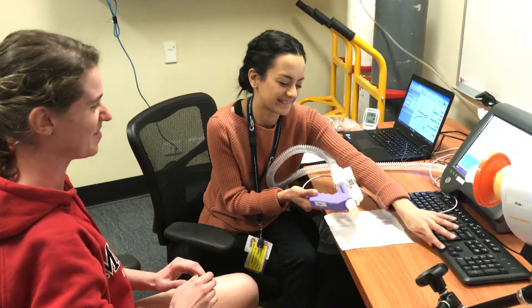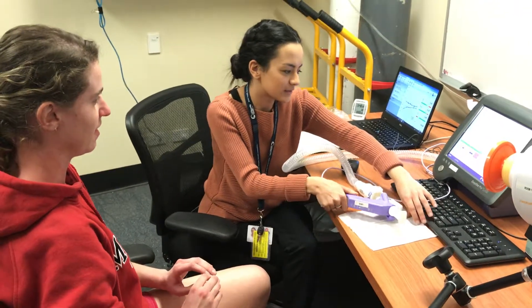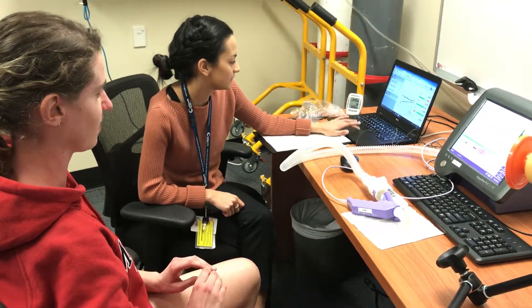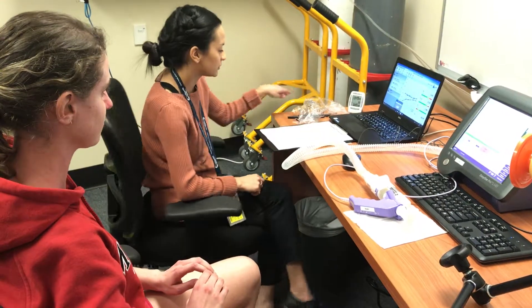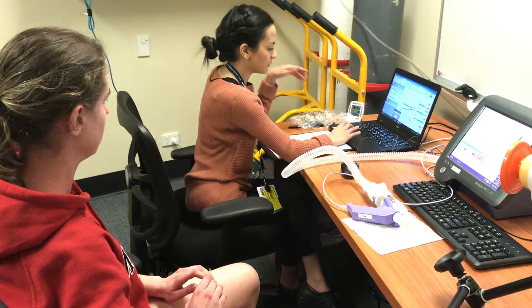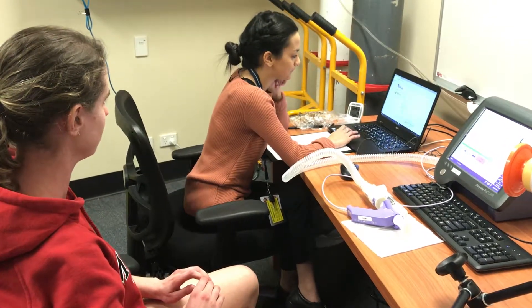It's a little bit dry. Now we'll just wait for the gases to flush out. Then we'll go on to another questionnaire. No worries.